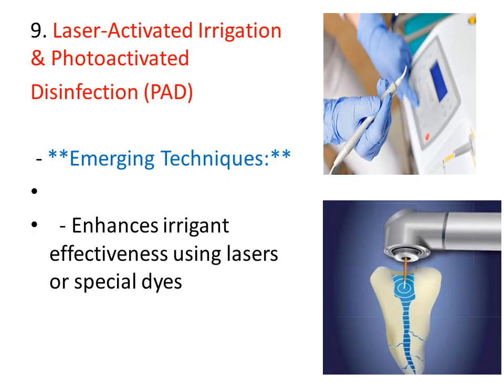Then, in the latest technology, we can use laser activated irrigation and photo activated disinfection, PAD, or laser. It is like a small laser machine with which we release laser radiation into the canal. It can completely eradicate and kill the microorganisms as well as dead pulp, which can later be easily removed with the help of EDTA and sodium hypochlorite.